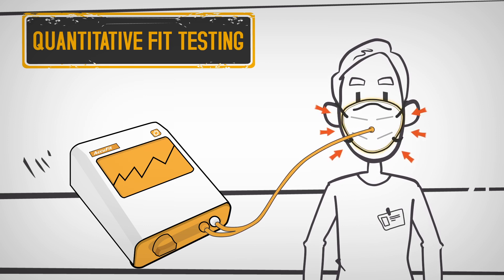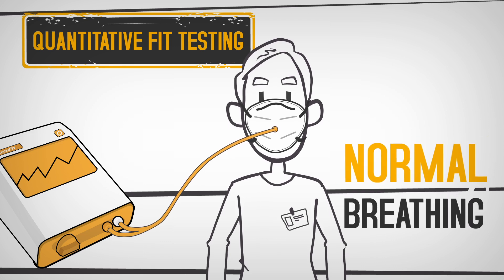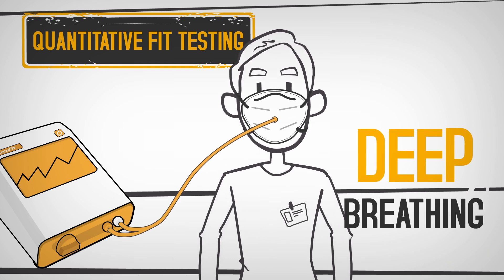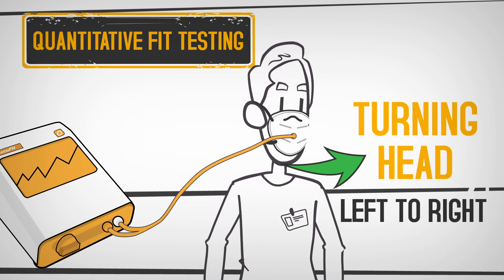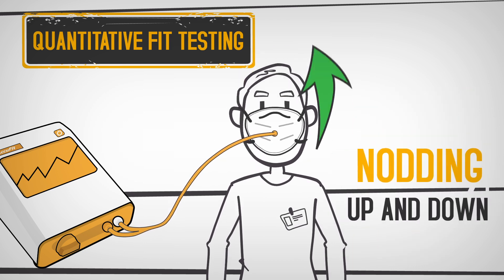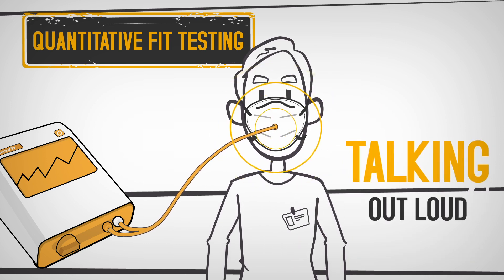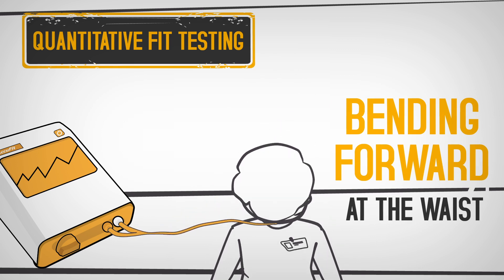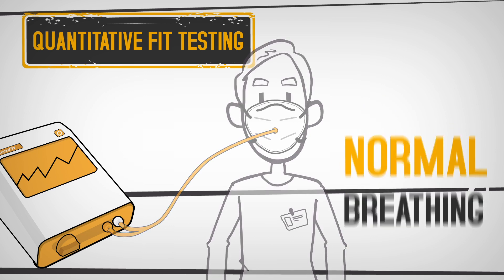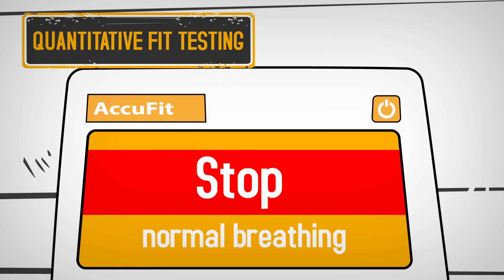While wearing the respirator, you'll be asked to perform seven exercises: normal breathing, deep breathing, turning your head left to right, nodding up and down, talking out loud, bending forward at the waist, and finishing again with normal breathing. The fit test machine will prompt you when to start and stop each exercise.